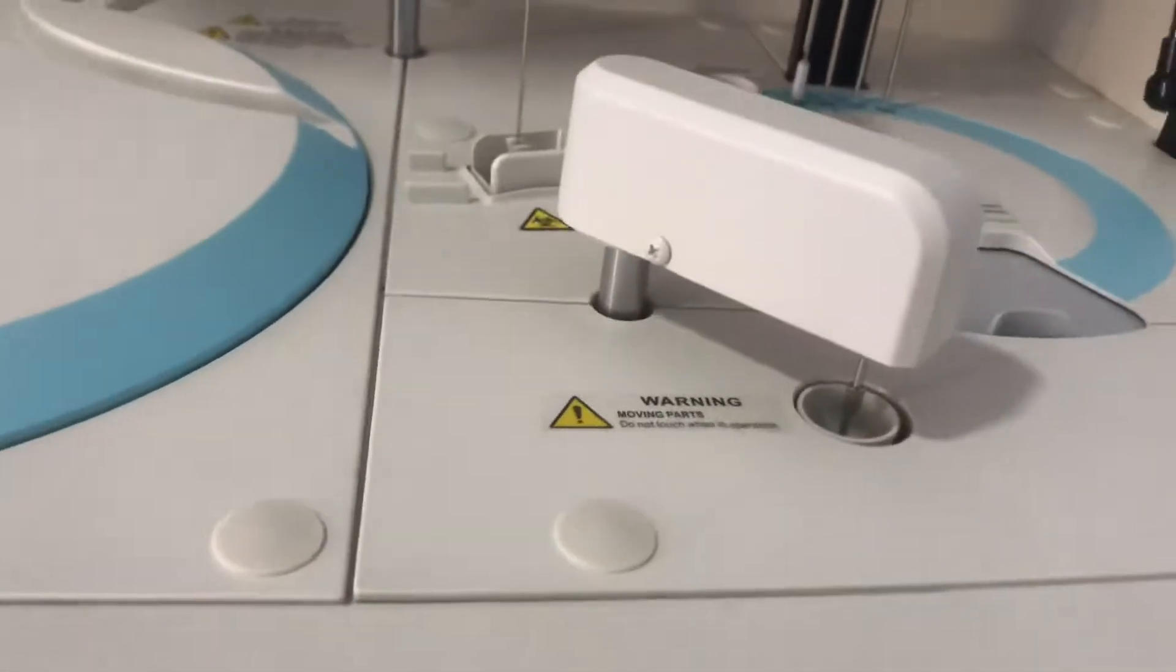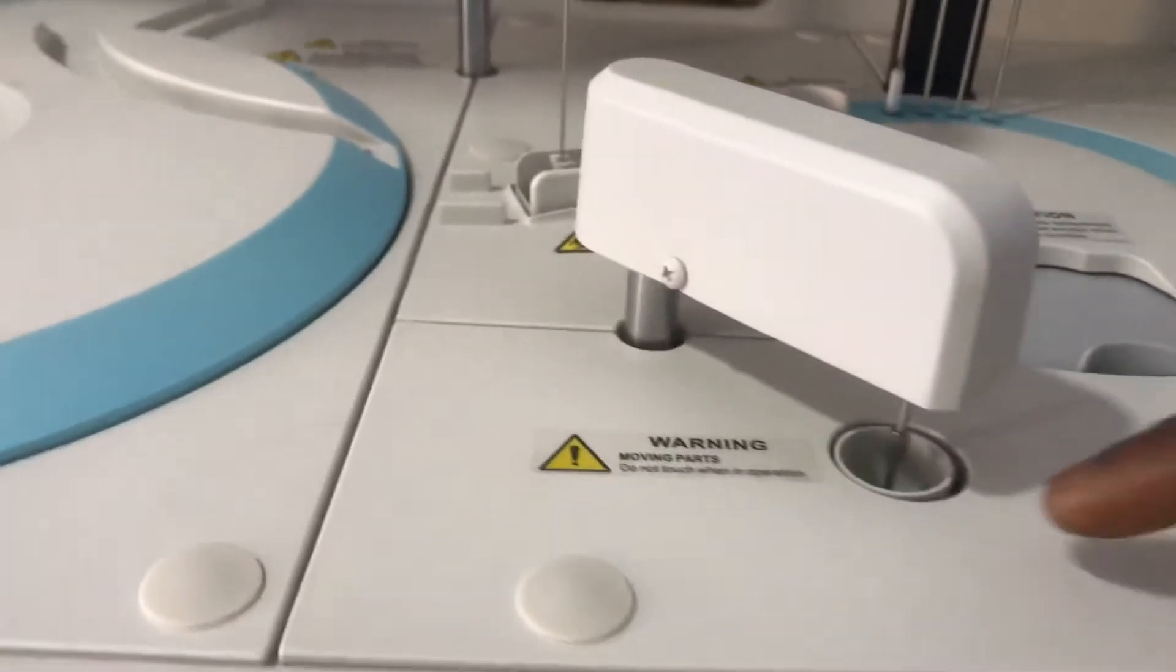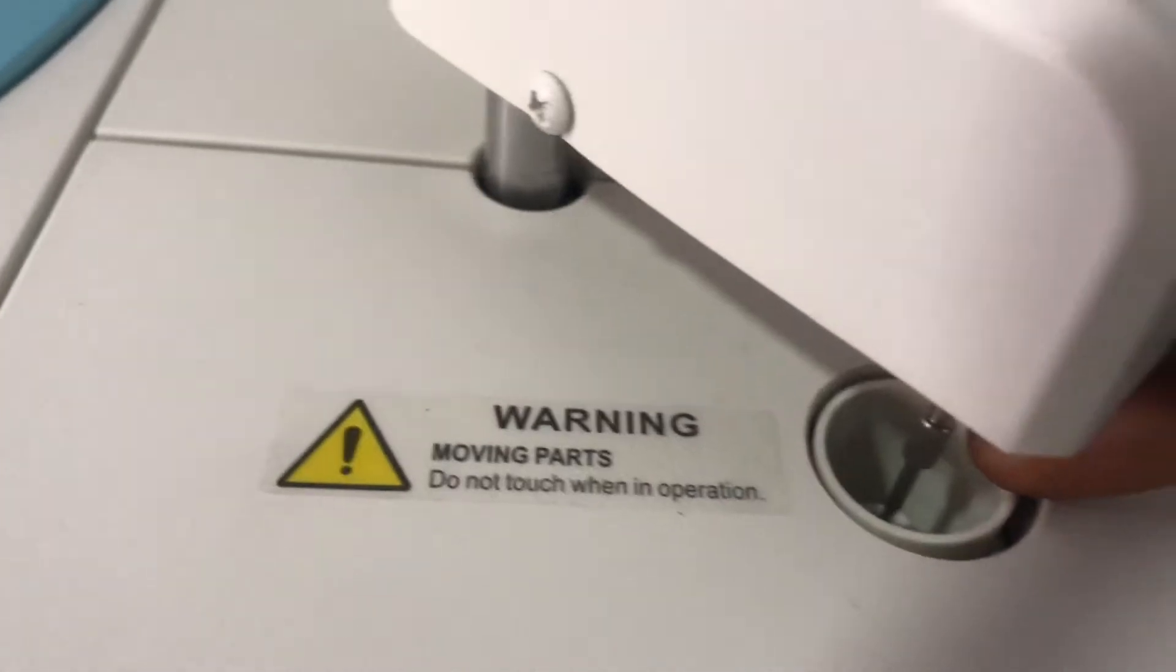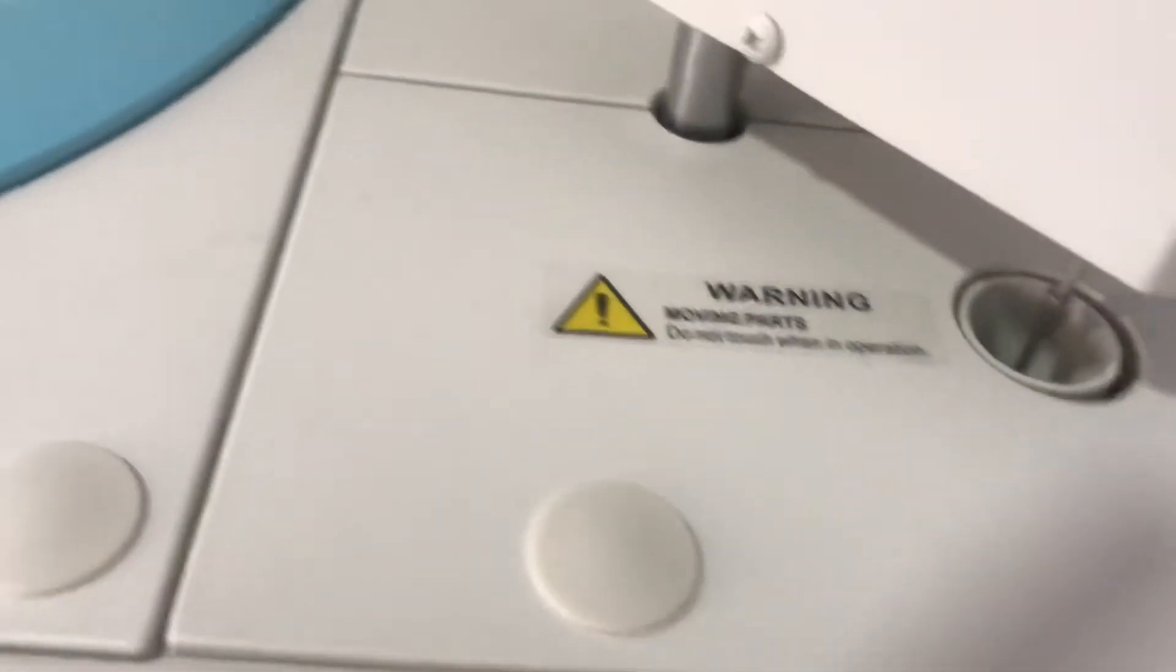What we have here is the mixer. This is the arm, this is the mixer, and that's the rotor. What it does is—and there's also a wash well here—after mixing it will come here and then it will be washed.